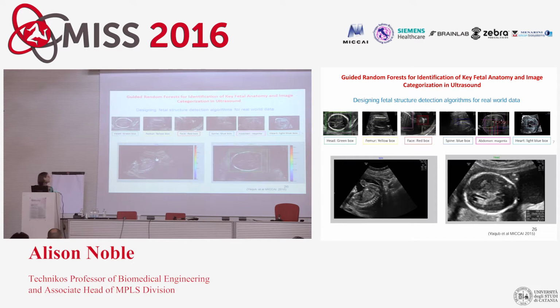The goal then is, if in clinical practice you were taking these measurements, if you look at the images here, rather than the boxes for now, these are all examples where measurements have been taken on the spine. You can see they vary a lot in their appearance, their scale, their position. And similarly, if you look at the heads, this one is generally a little bit easier because there's a stricter definition for measurement. You can see the heads in different positions.